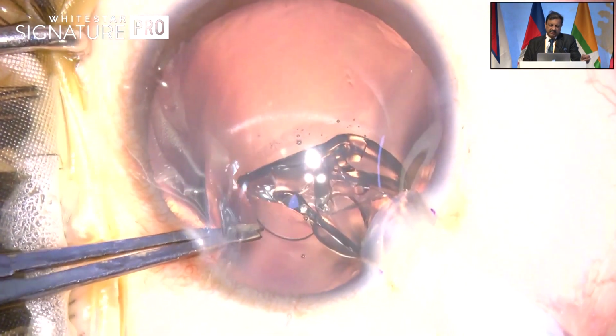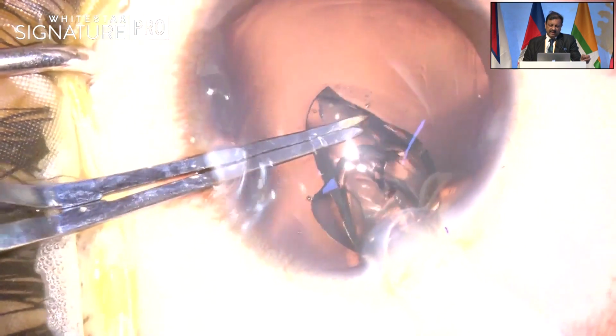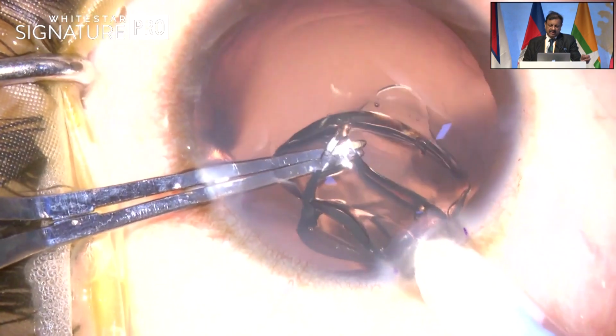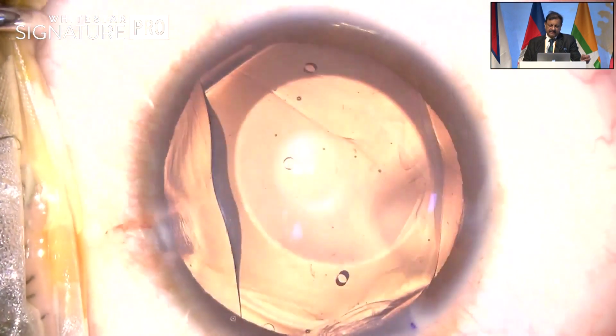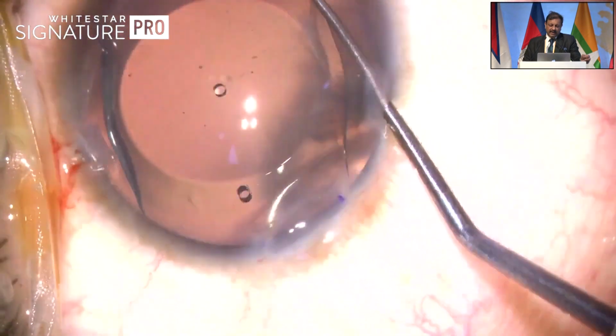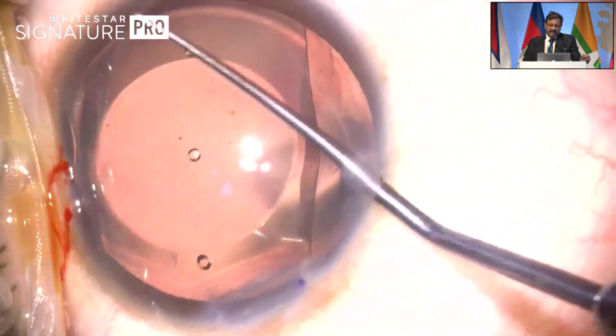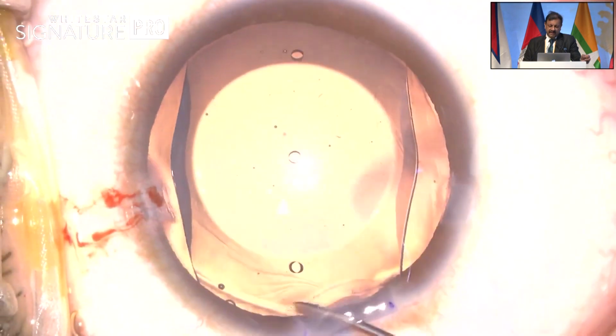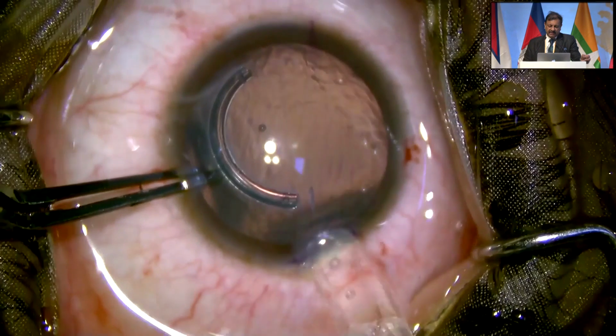Again, the same situation where the haptic, the leading plate has been caught, and watch how clumsily the lens opens up. So loading is a very, very essential part for a successful implantation of an ICL surgery. It should always be done under the microscope.